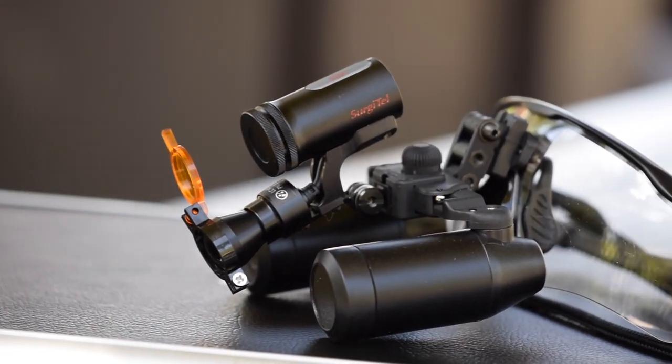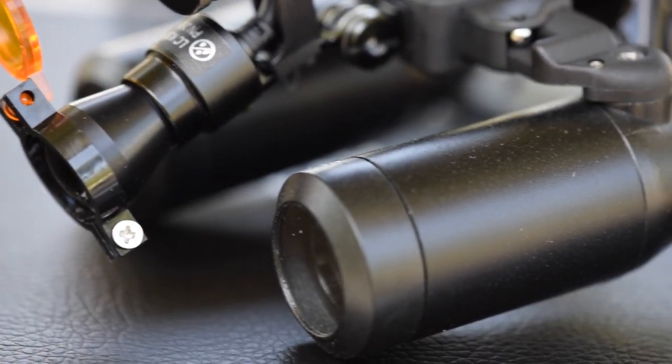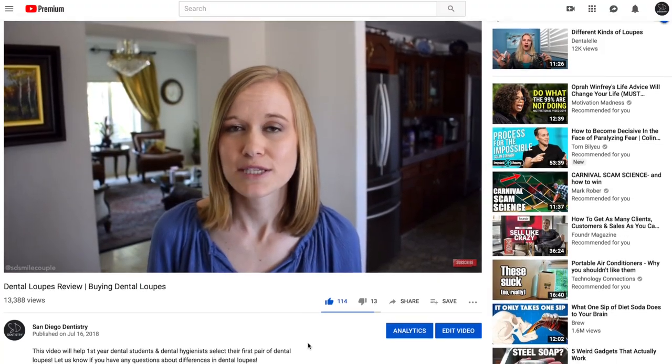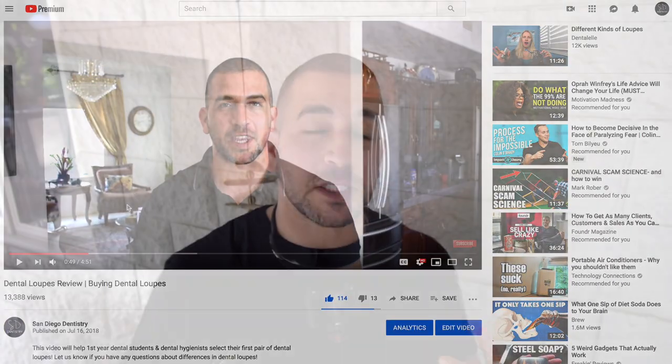Today, we're going to take a closer look into my new Surgitel 6.5X Loops. Last year, I made a video reviewing my loops and talked about how magnification played an important role in my decision, as well as some of the features that helped me serve my community every single day. Thousands of patients later, and I can honestly still say that those loops are holding up strong.